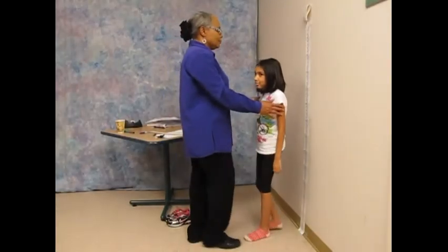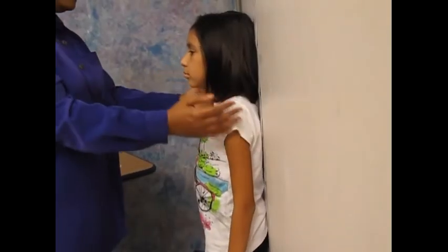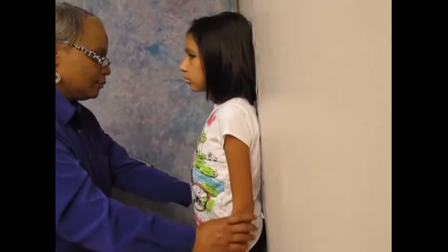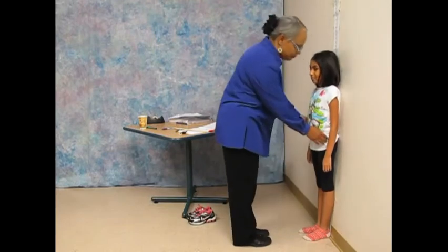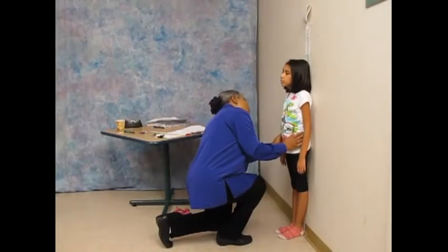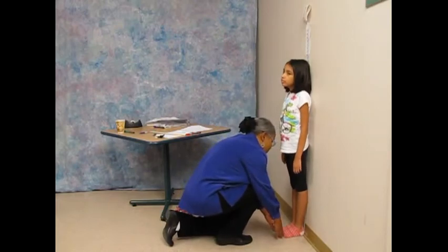First, ask your child to stand with their back against the height chart. Make sure they're looking straight ahead with their shoulders level and their arms straight at their sides. Next, check that their upper back and their buttocks are touching the chart. It is okay if the lower back does not touch. Finally, make sure that their legs are straight, their feet are flat and together, and their heels are touching the chart.